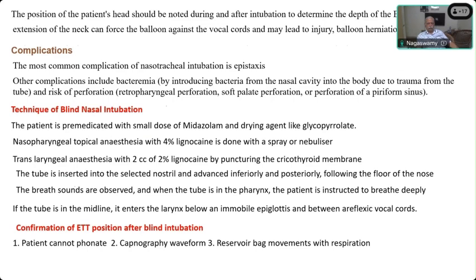This is a very important instruction that you have to give, because I had a bitter experience of intubating an IAS officer without telling this, and I succeeded in my first attempt in passing the tube into his trachea. And immediately he became agitated and he started showing signs that he wants to write something. So we gave him a paper and a pen, and immediately he wrote, "I cannot speak." Then only I realized that I should have told him that he will not be able to speak. So I had to explain to him that because the tube is there, he won't be able to speak.